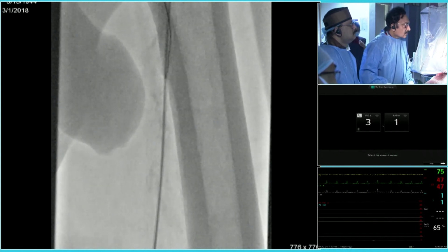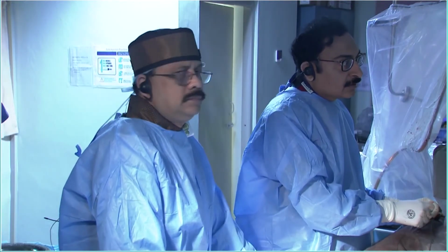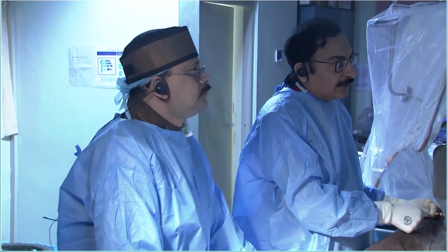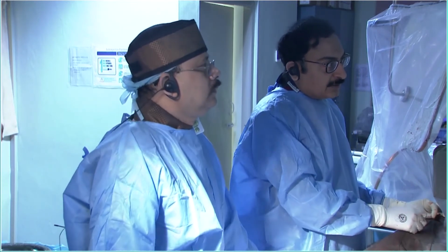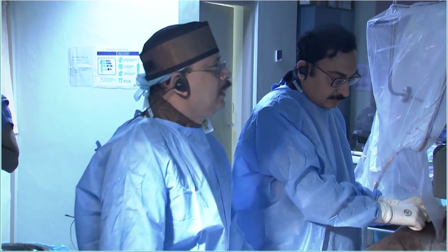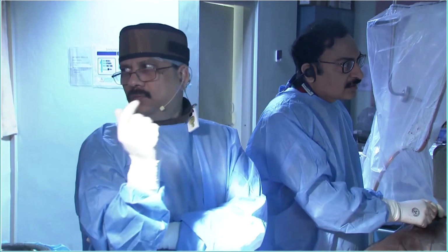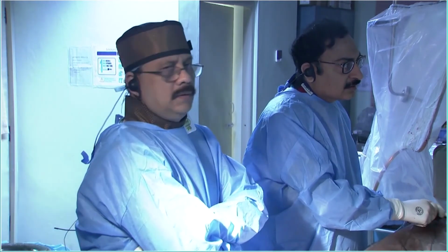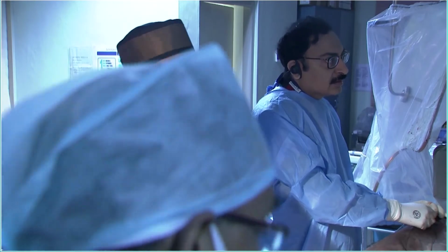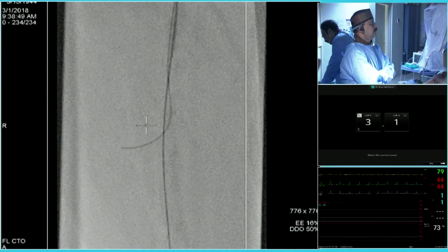Can you switch us to the other location in MMM? Dr. George Joseph is ready with his talk. Okay, so Dr. Erilin, we are getting in with you, the second wire. Can we see the fluoro? Sure. Switch to fluoro.